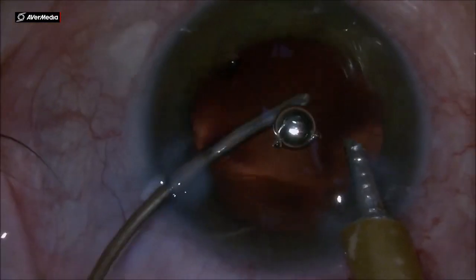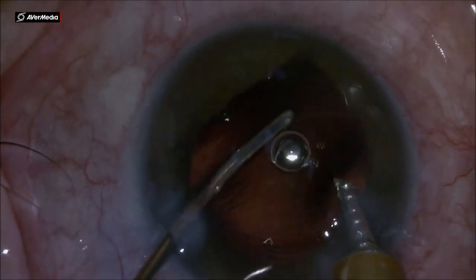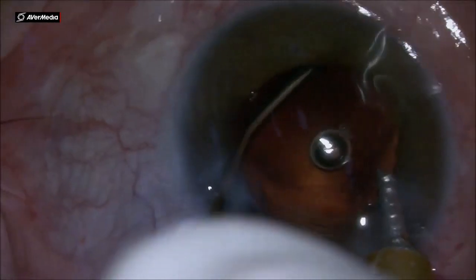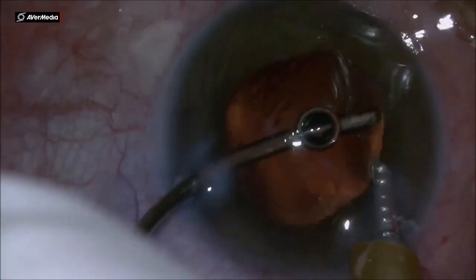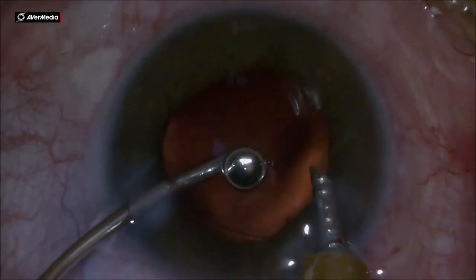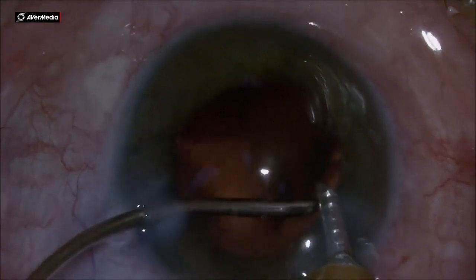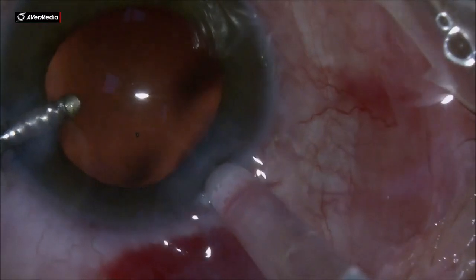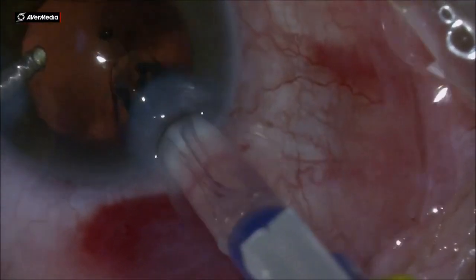It's good to have a clean bag at the end of phacoemulsification, and for the last cortical remnants I use an aspiration needle and AC maintainer into the main incision to finish up the last cortical removal part. And underneath the main incision, I always have to check. In this case, I find a big chunk of cortex.